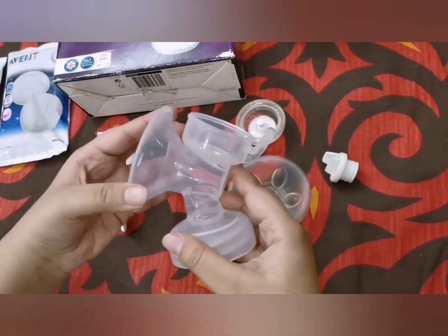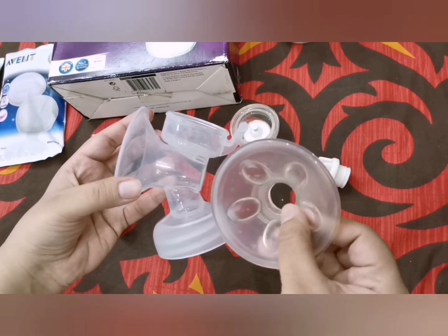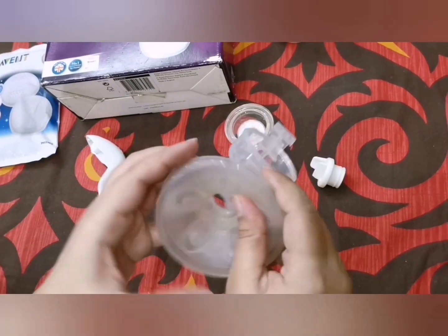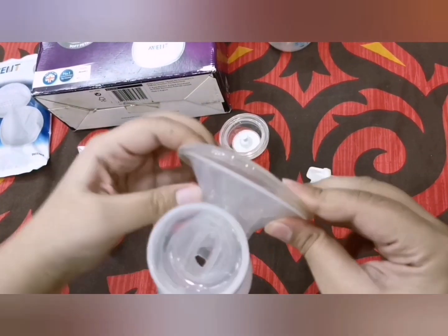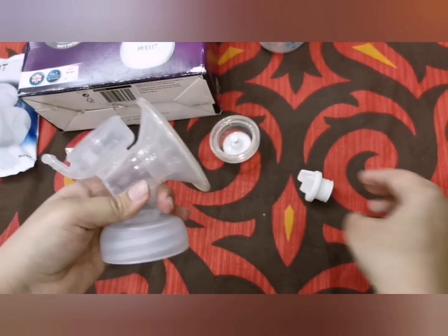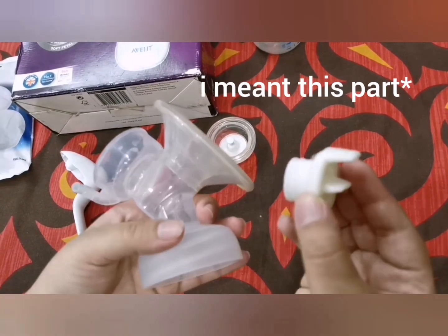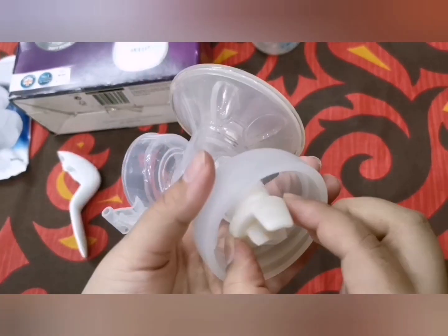The breast pump comes with five parts. This is the main body, and this is the soft cushion area which attaches here like this — very easy to fix onto it. You just put it over here in this area.